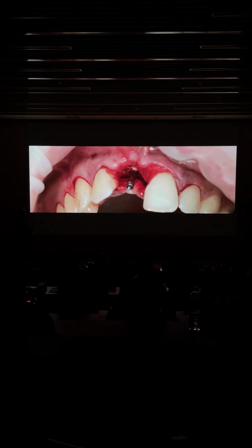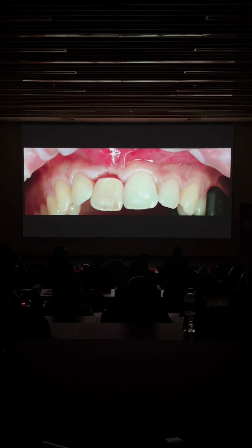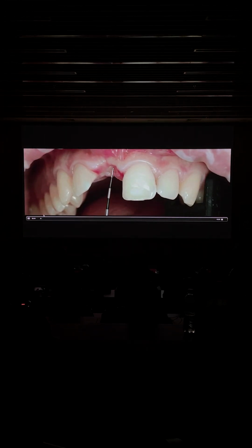This is the 7 millimeter healing abutment. Not all the systems have such a high healing abutment, which for me is essential. For example, Straumann, the highest is 5 millimeters, which is a little short for me. Usually I place way too much soft tissue on the buccal aspect. You will see that this will create a problem later on.